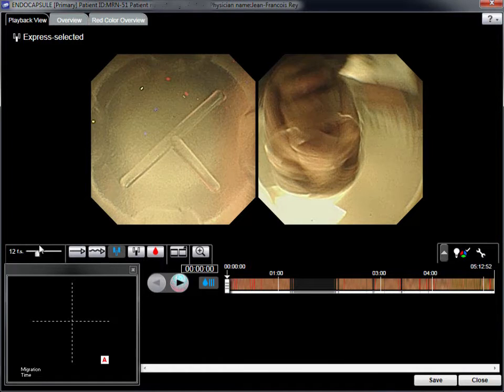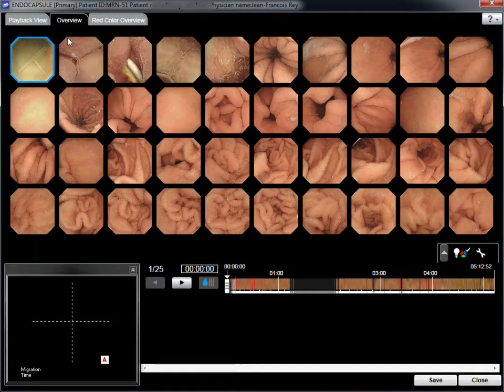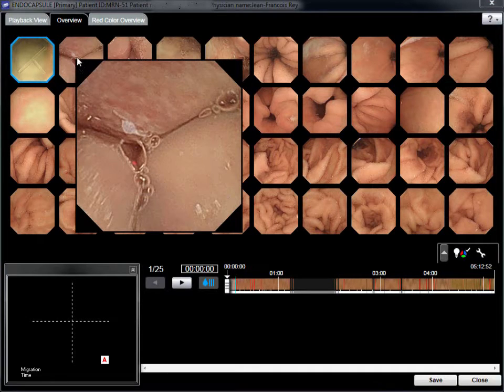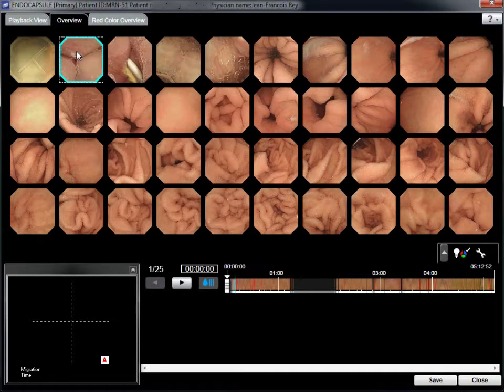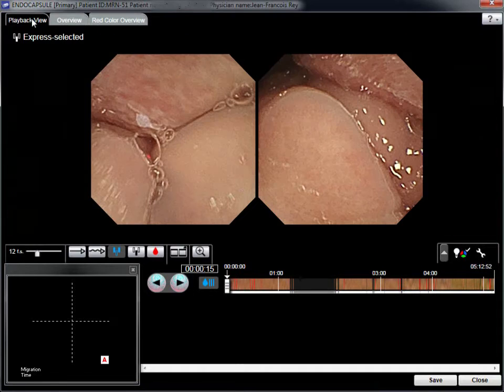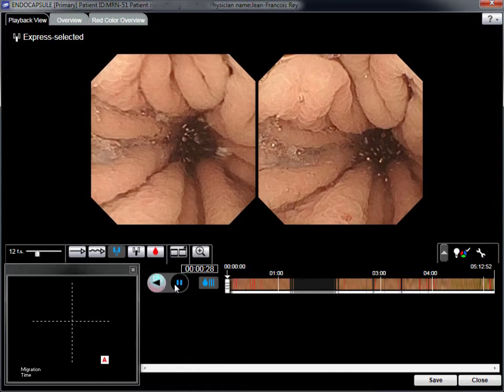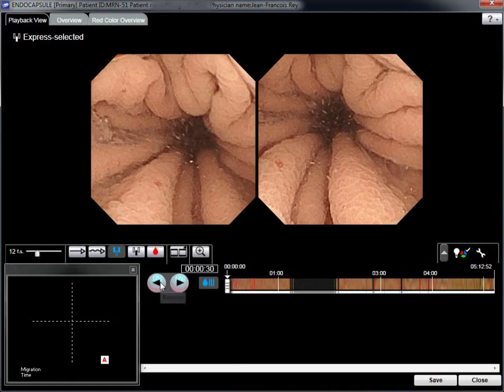The overview mode displays a global impression of the capsule examination and allows selection of landmarks, such as the first gastric image, the first duodenal image, and finally the first cecal image. At each stage, isolated images are assessed by using the various functions, especially forward and backward. Adequate pictures are stored as thumbnail images.